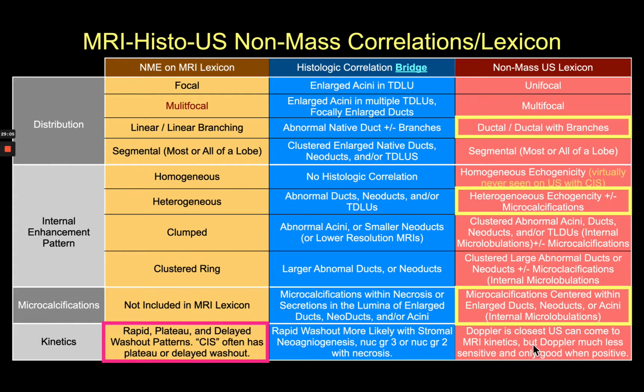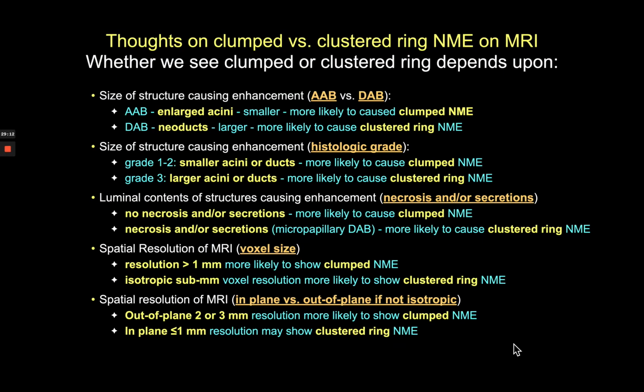We don't have, Doppler is the closest ultrasound can come to MR kinetics, but Doppler is much less sensitive and really only good when positive.